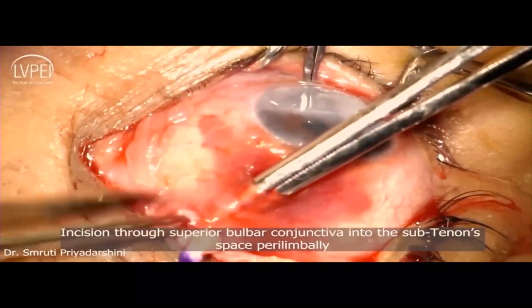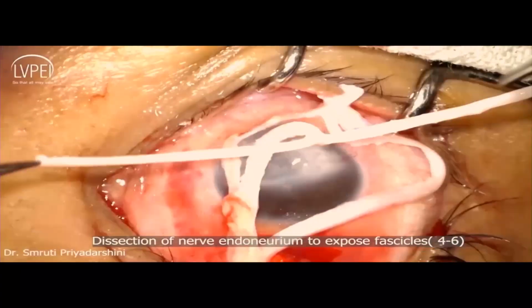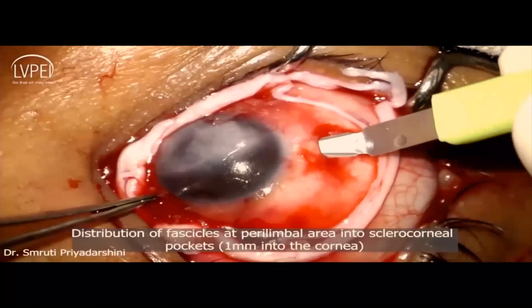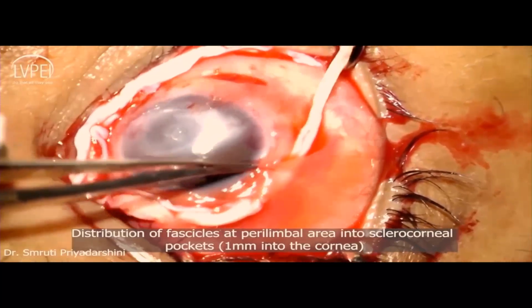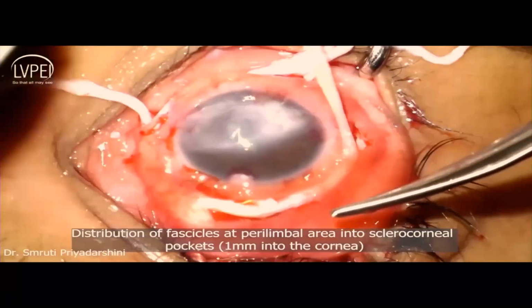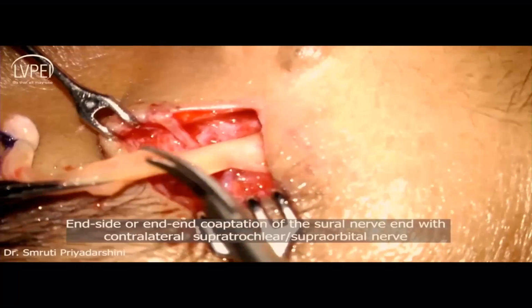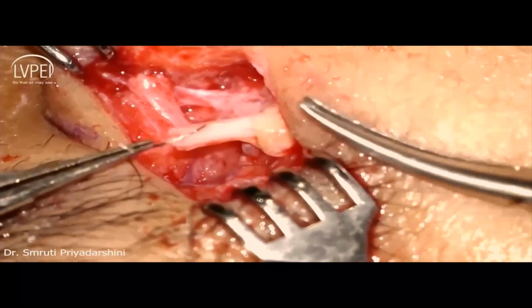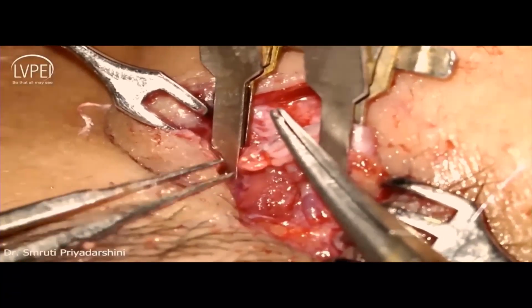the perilimbal area. The nerve was dissected to expose 4 to 6 fascicles. A 360-degree peritomy was done and sclerocorneal pockets were made 1 millimeter into the cornea. These nerves were then dissected at appropriate length and passed into the sclerocorneal pockets. Fibrin glue was applied and the conjunctiva was closed using 8-0 Vicryl sutures. The other end of the sural nerve was dissected and end-to-side anastomosis with the supratrochlear nerve was performed, and the blepharotomy incision was closed.